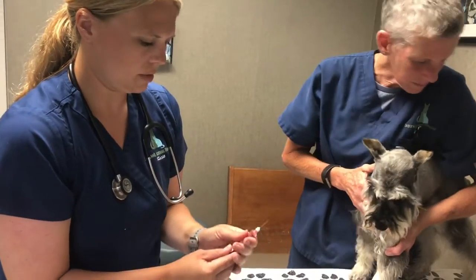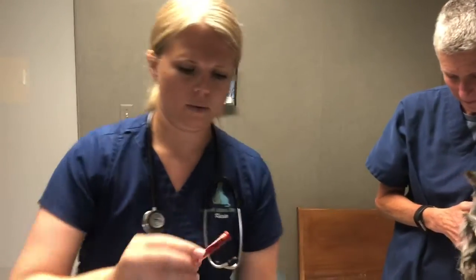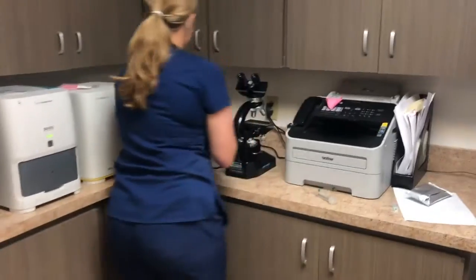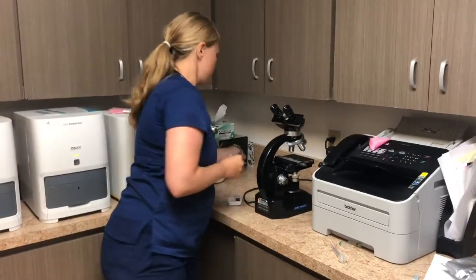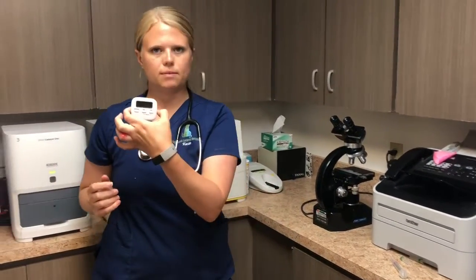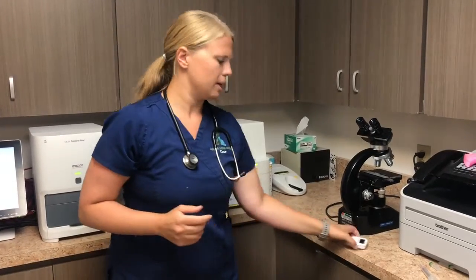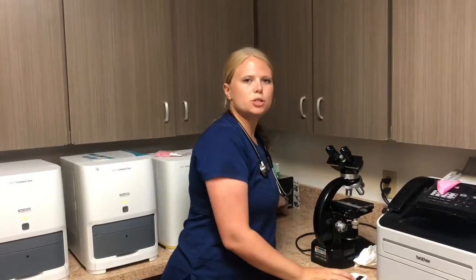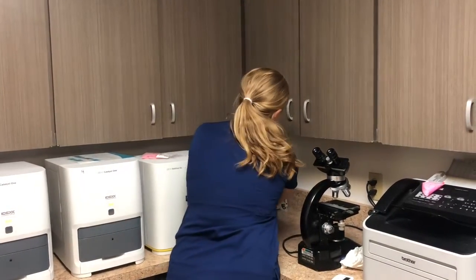Alright, I'm going to go ahead and just invert it once, wipe off a little bit of the excess around it, and replace it back in the incubator for about 60 seconds. I've got my timer going, and I'm going to come back and check and see if we've got a clot. And now that we are just about at the 60-second mark, I'm going to take my tube and invert and see if there is an active clot.